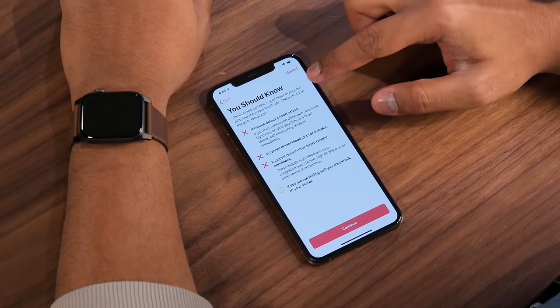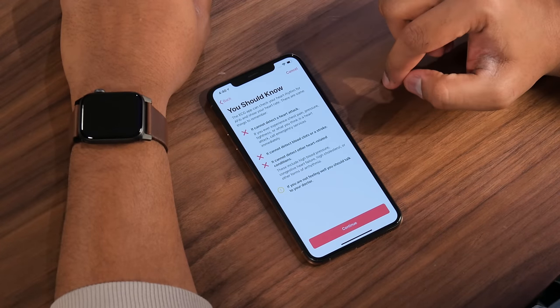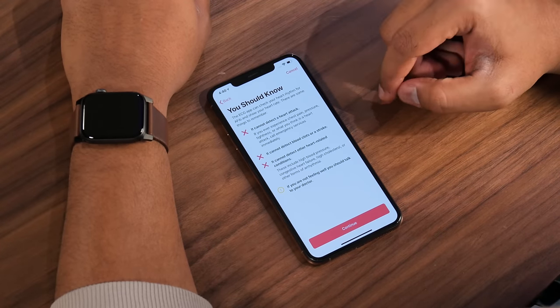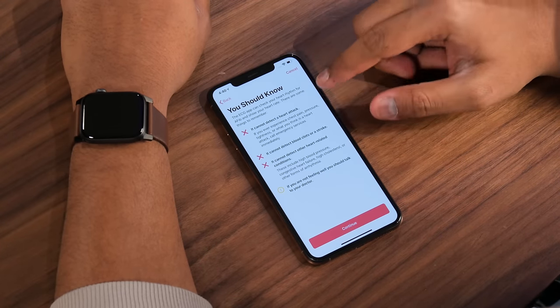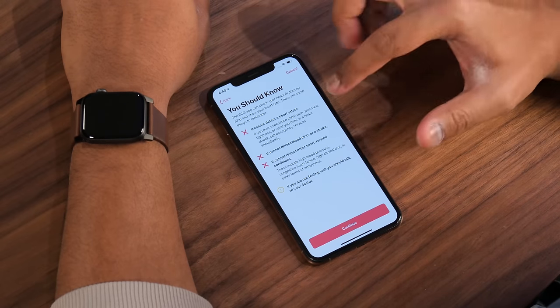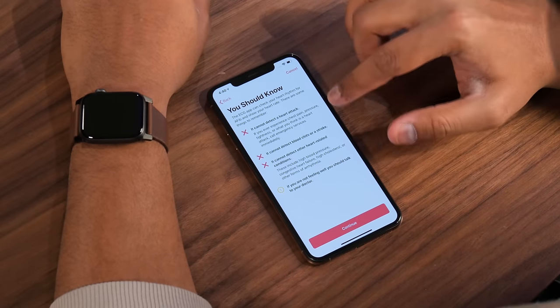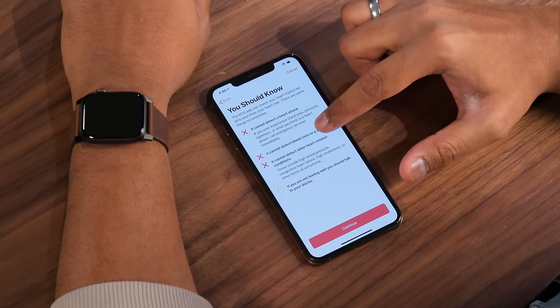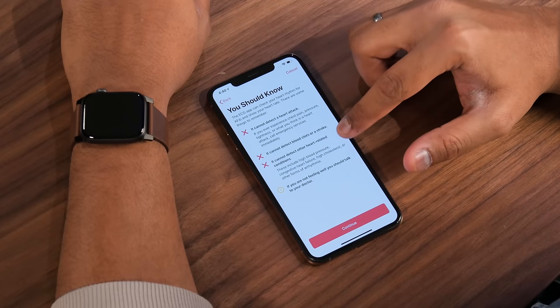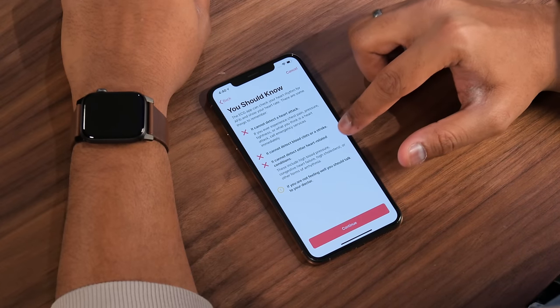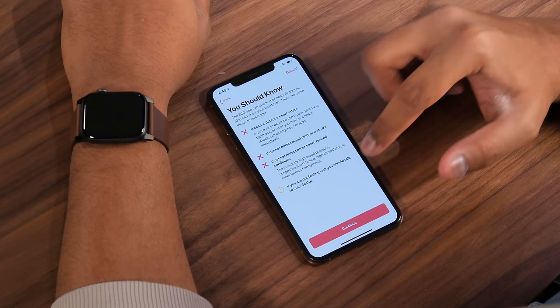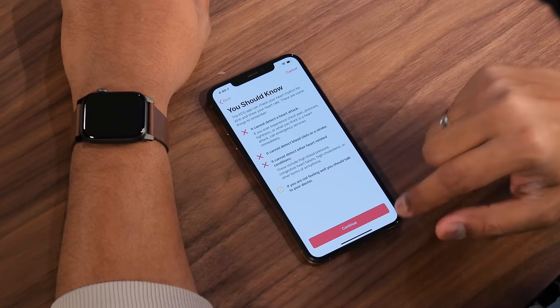There are some important things to remember. This ECG app can check your heart rhythm for AFib and show your heart rate, but it cannot detect a heart attack, so don't solely rely on it for that. It cannot detect blood clots or a stroke, and it cannot detect other heart-related conditions. If you're not feeling well, you should always talk to a doctor.